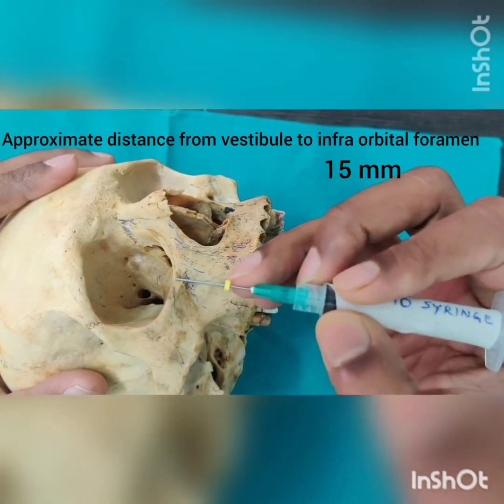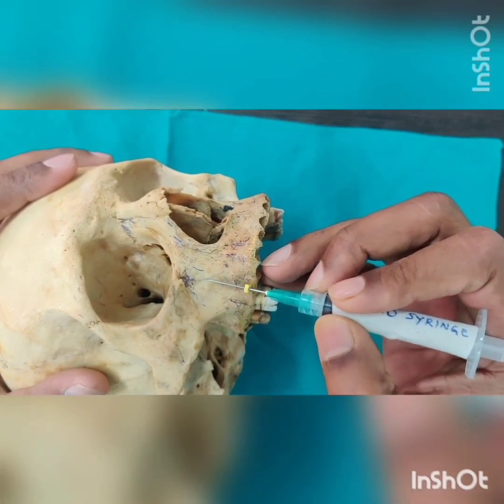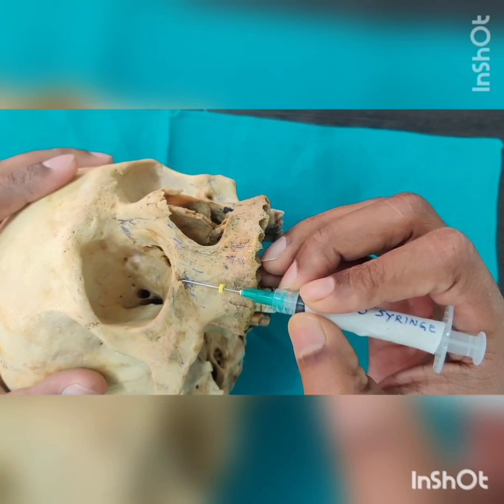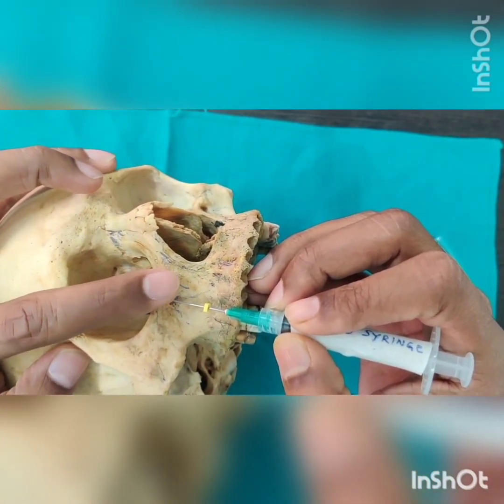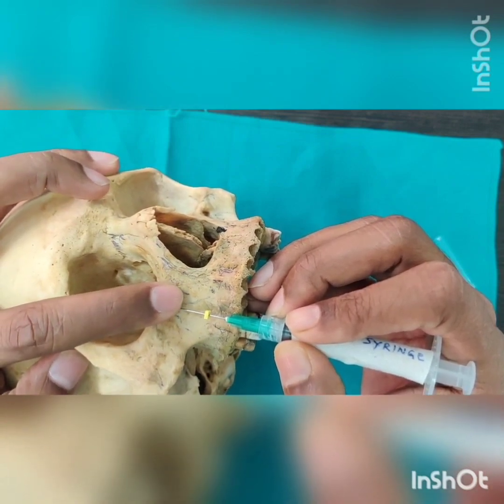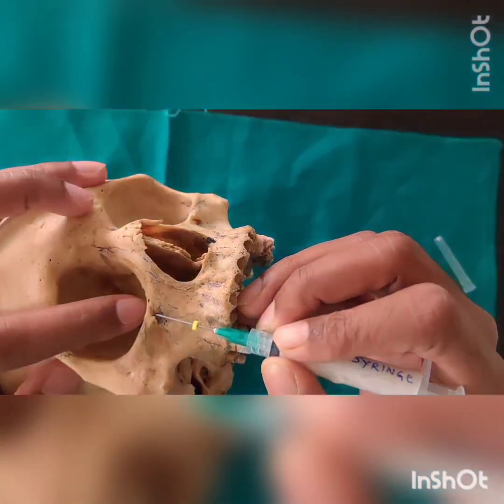The stopper has been set for around 15 millimeters. When the needle slides along the bone to around 15 millimeters, you will be able to feel it from the skin area as you deposit. The final position will be in the infraorbital foramen area.